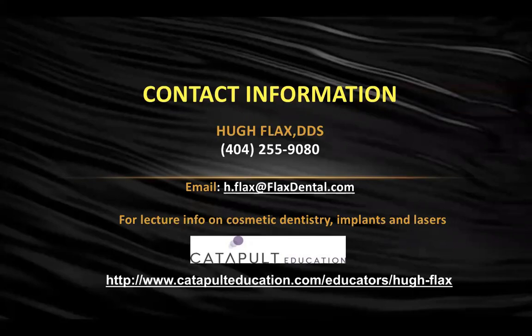I know there's some cheap ones out there. I just use the one that has been my go-to. I mean, yeah, you want to cut some costs. That's not a place I want to really cut costs. And I put that on and let that sit for 15, 20 seconds. Dry it off. Some people like to rinse it. And then I go ahead and put my bonding agent on there. I haven't seen, knock on wood, veneers coming off with it.